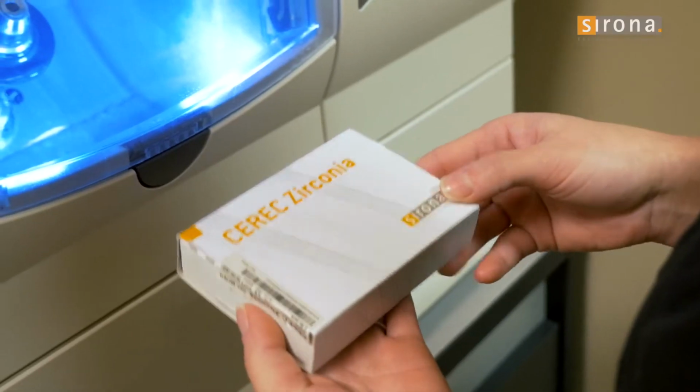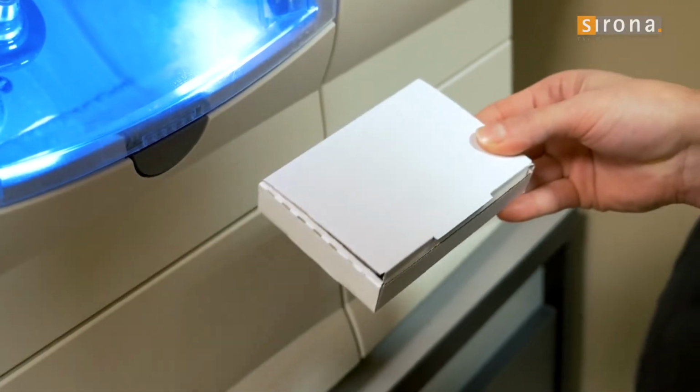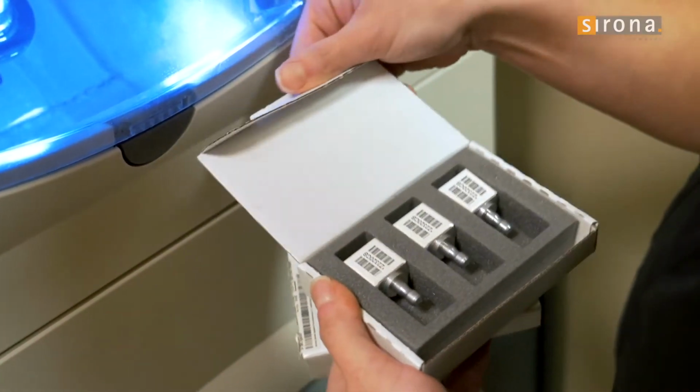So when it comes to the preparation itself, nothing much changes, and a lot of that is due in part to Cerec Zirconia, our newest material available for chairside CAD/CAM systems. And because it's a solid zirconia crown that we're going to be fabricating, the dentist really has nothing they have to change about their preparation. In fact, they can prepare the tooth much the same way they would prepare a cast gold crown.